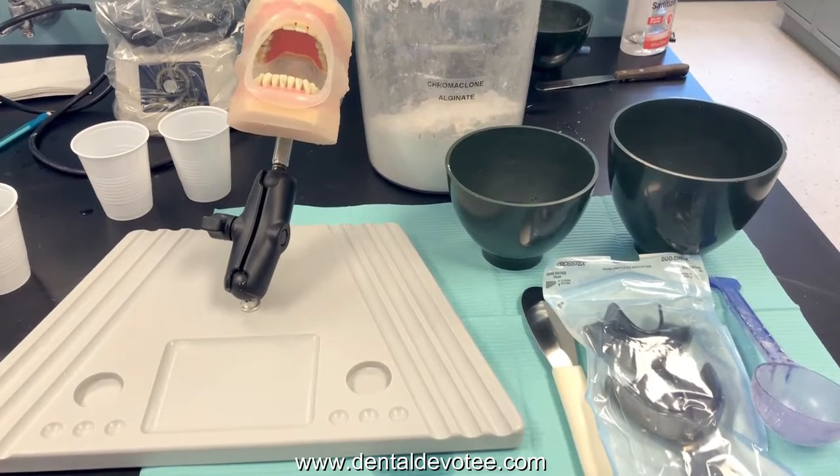Hi everyone! This video will show you how to mix, load, and place alginate. My demonstration will use a mannequin, but in practice I find it easier to take on a real patient.